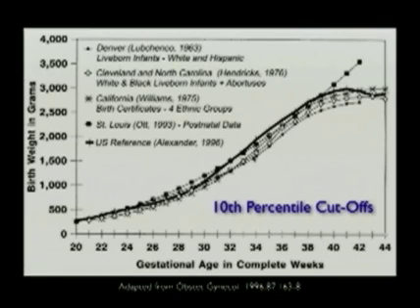So if you find a fetus and you use a weight calculation and a percentile chart, say for instance at 34 weeks or 33 weeks, you can see that the dot resides above this line or below this line. The point is you can really interpret the information differently depending upon which population standard is actually used to interpret your fetal biometry.